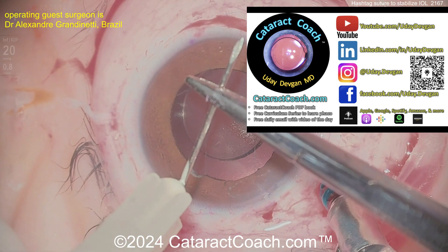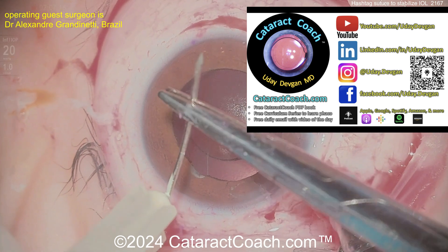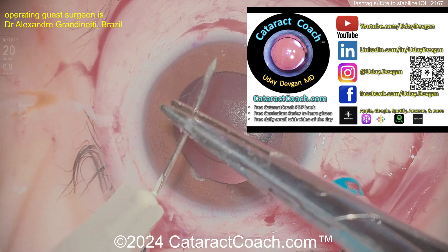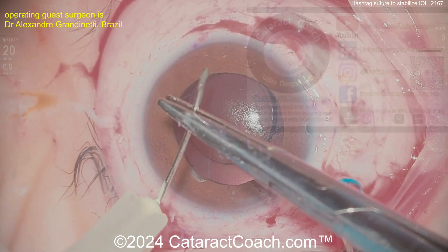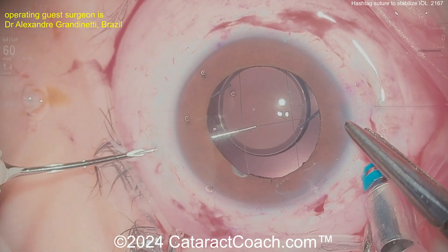Let me tell you about CataractCoach.com, my teaching website — a lot of free material there: the free book, the curriculum series, the Iowa Calc series, the Fake or Fundamental series, and the podcast where every week I have a brand new episode. Now here the surgeon is just bending that needle to get a little bit better access.